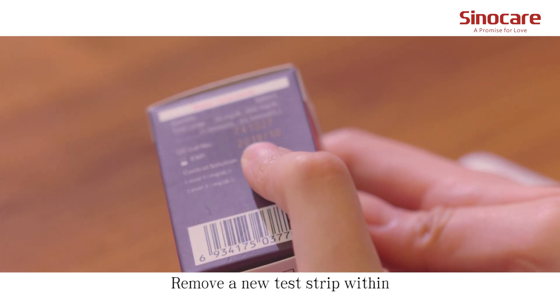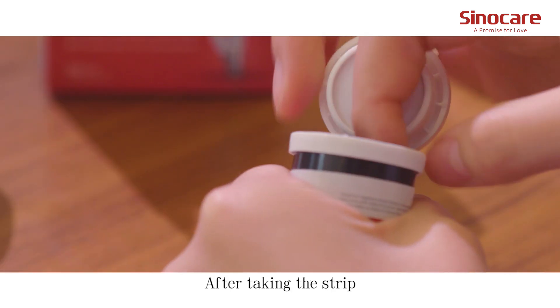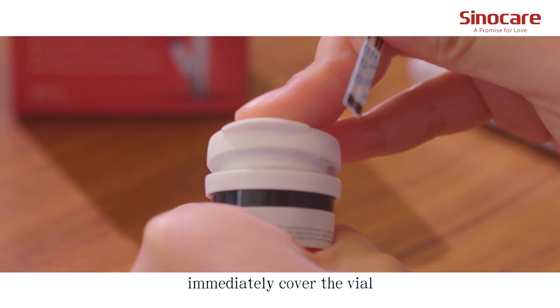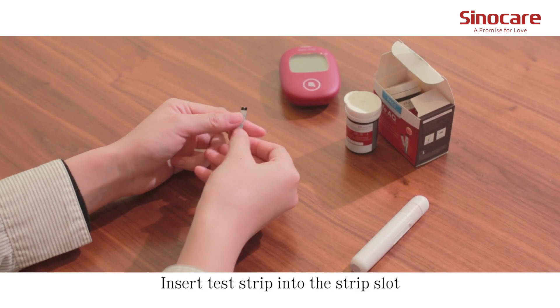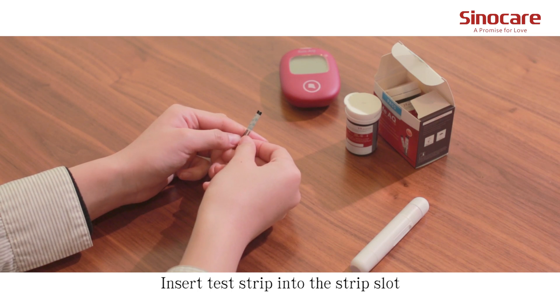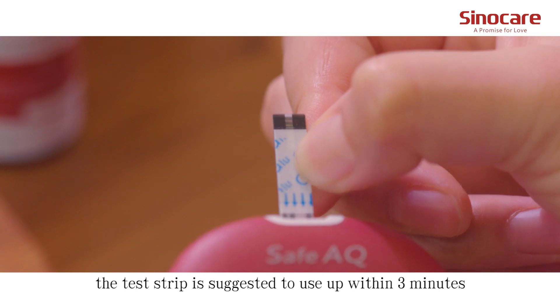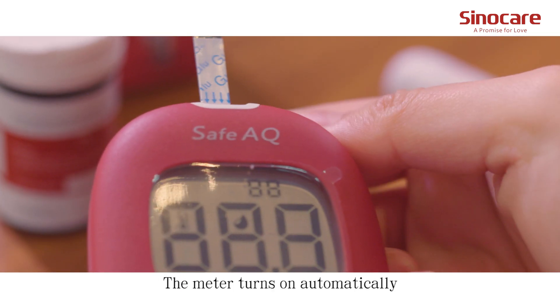Remove a new test strip within the valid expiration date from the vial. After taking the strip, immediately cover the vial to avoid losing efficiency. Insert the test strip into the strip slot. The test strip is suggested to be used within 3 minutes. The meter turns on automatically.